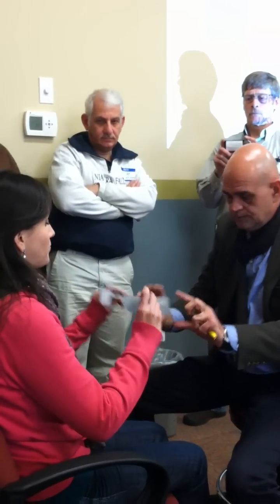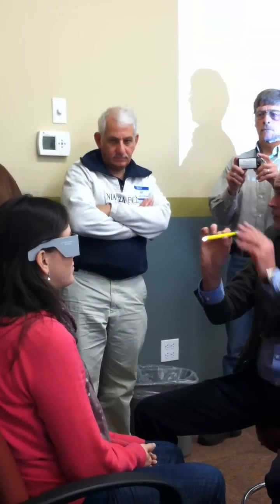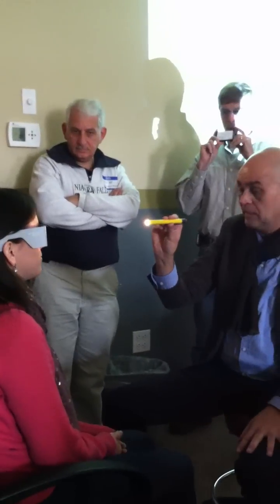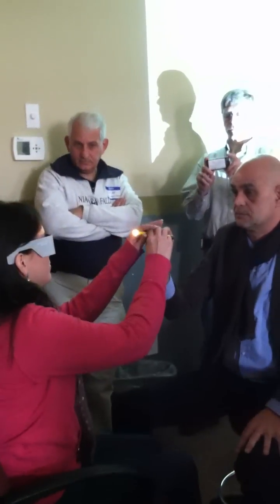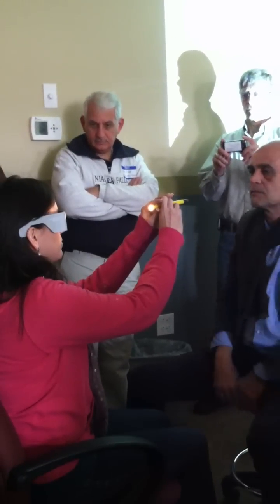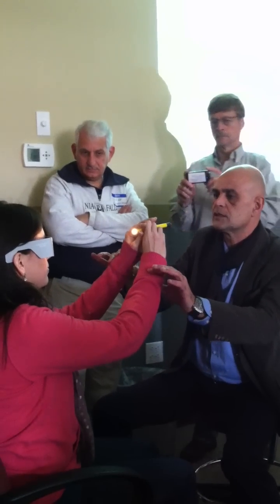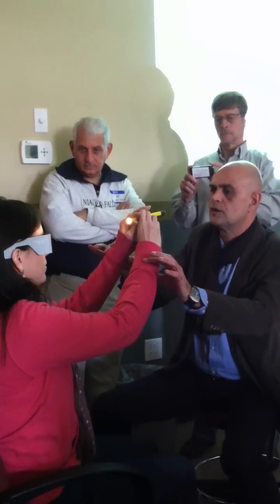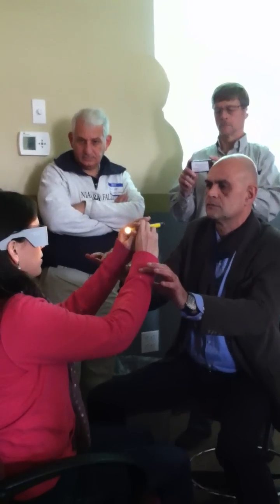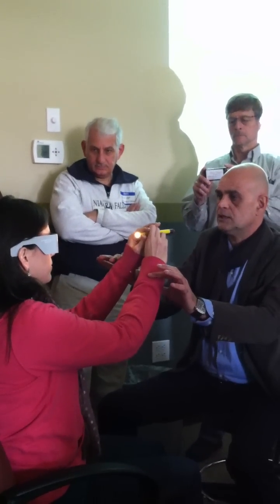And now you can put it on. Clips. You can hold the pen light yourself with both hands. Is that okay for you? Yes. Is it difficult? No. You like the color? Yes. Can you move it like this? But very, very slowly. Up and down? Yeah. You got it?